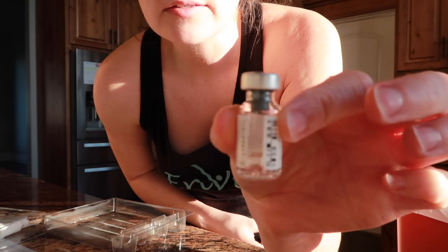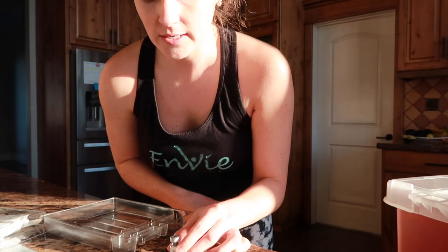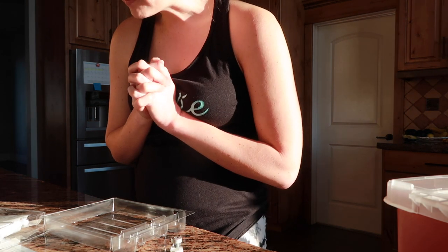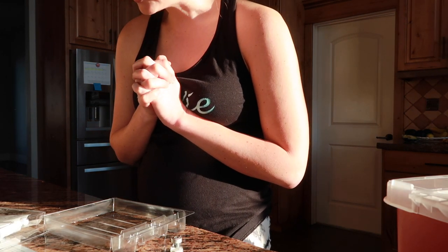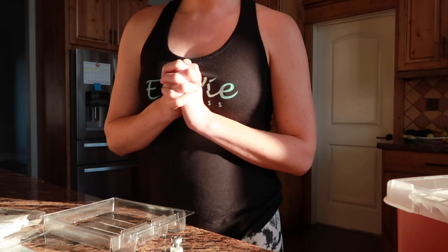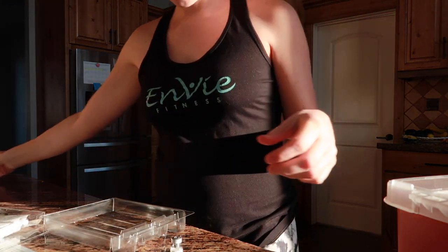It's nice and clear — you're not going to be able to see but it's clear. It says to allow the solution to adjust to room temperature prior to administering your injection. Pretty sure it is room temperature because it's been at room temperature, so this goes in the trash.